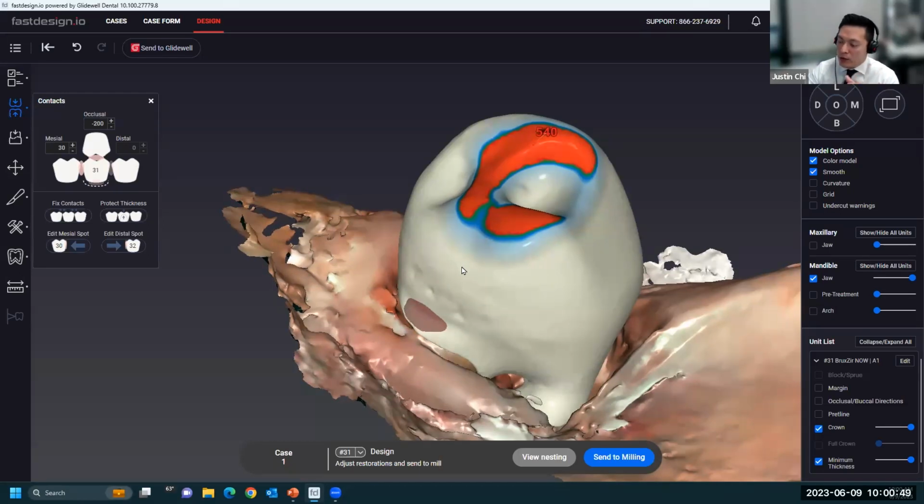But with other materials like glass ceramics, hybrid resins or composites, or PMMA, you want to err more toward 1 millimeter or greater in your final restoration. And it is also factoring in the cement gap. So digitally, we didn't really have time to talk about that, but there is a cement spacer that is created to allow for room for the cement to occupy between your restoration and your prep.